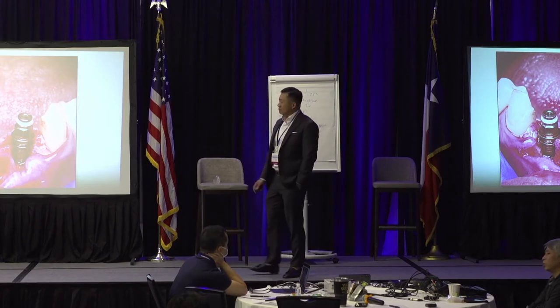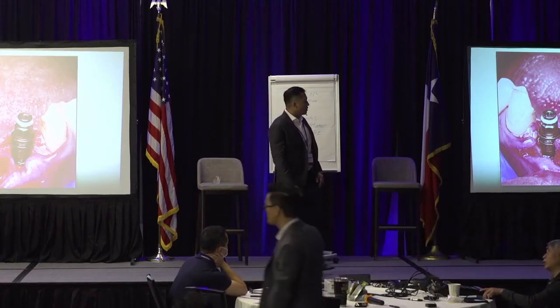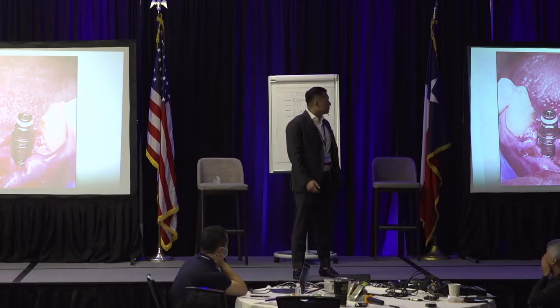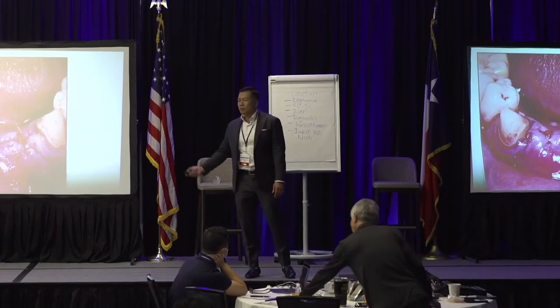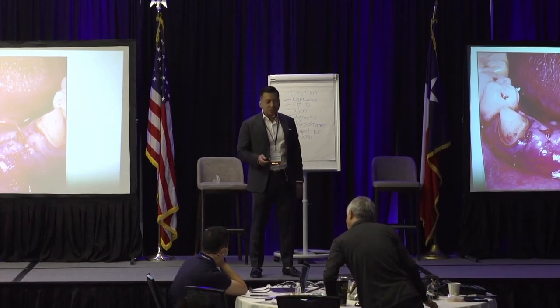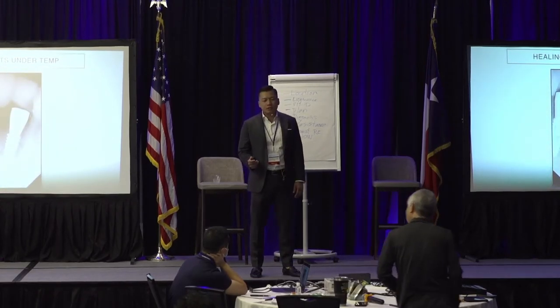Okay. This is one of my first cases a long time ago. I can improve a lot of things on this case. But I placed the implants. You see the perforations in the bone. Did the ridge augmentation closure. When you do a ridge augmentation, it's going to be the biggest thing. So get closure. You can see I prepped the 22 and 27 just for a temporary prosthetic. Let the patient heal for 6 months. There's the PAs of the anteriors.